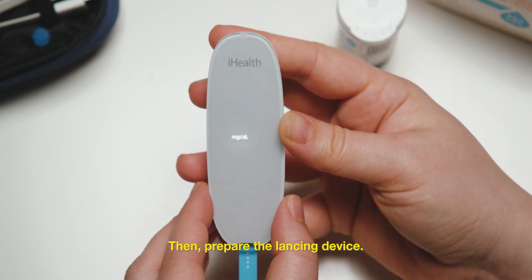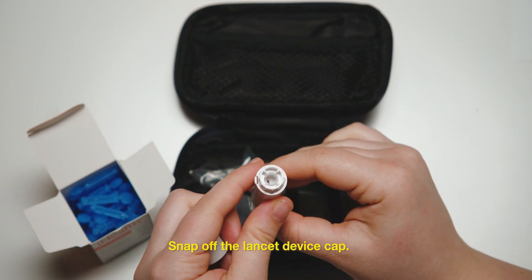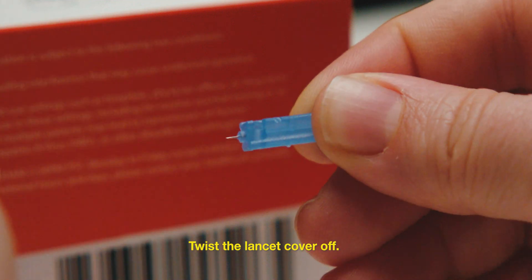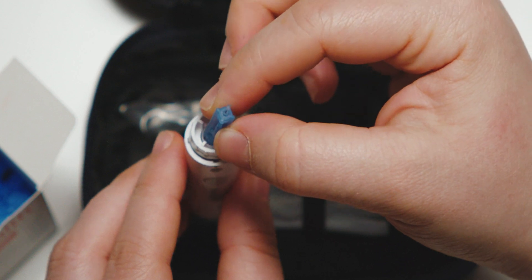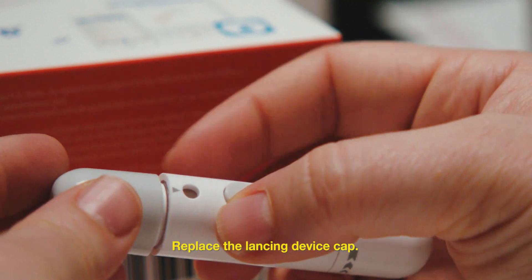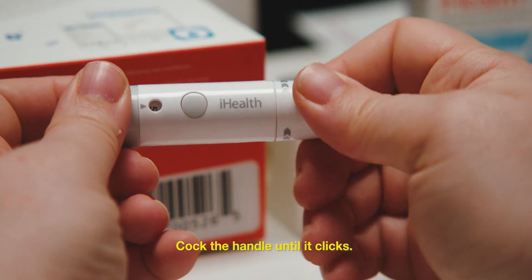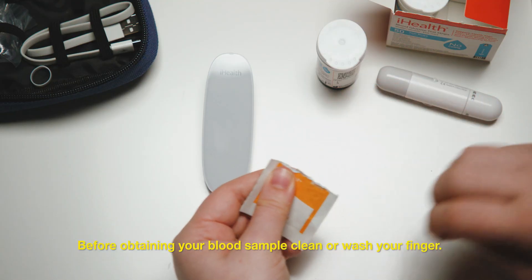Then, prepare the lancing device. Snap off the lancet device cap. Insert a new lancet firmly into the lancing holder cup. Twist the lancet cover off. Replace the lancing device cap. Set the lancing level. Cock the handle until it clicks.